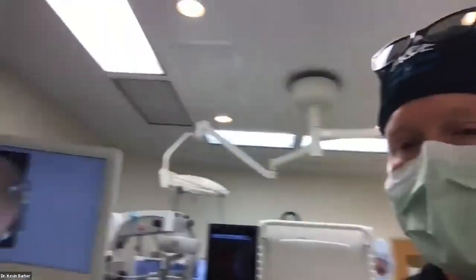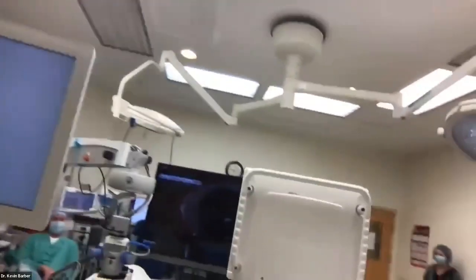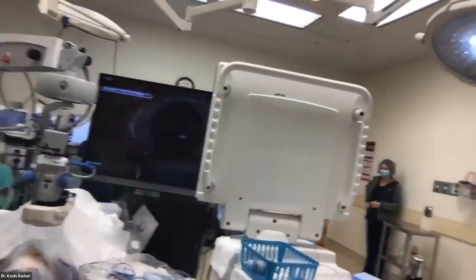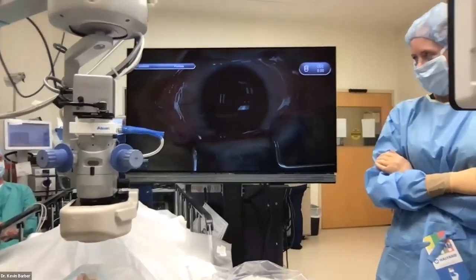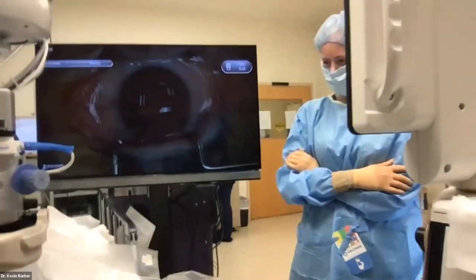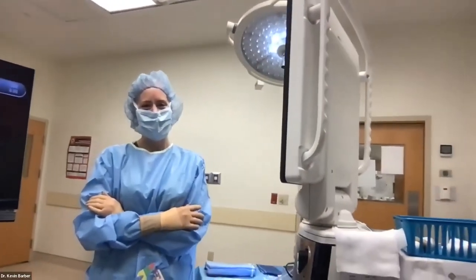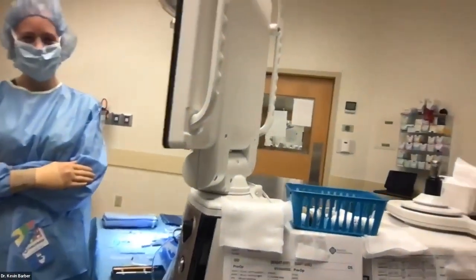Let me give you a quick tour so you can see how the OR is set up. We've already done the femtosecond laser for this patient — you can see the patient and the microscope. I'll be using the Ingenuity, which is the 3D visualization system, so we'll be broadcasting from that for excellent visualization. Jess, my assistant and scrub tech, is standing to my right with the FACO machine. That gives you some perspective on a technology suite for refractive cataract surgery.